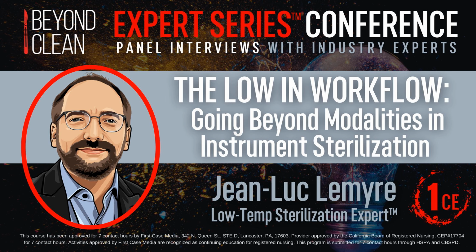Yeah, so limitations are different based on the models and cycles, but generally they revolve around the type of device, and you mentioned lumens. Lumens are very challenging to sterilize. We need the sterilant to penetrate through them, so the diameter and length of the lumen matter. There are specific claims per cycle and sterilizer that users need to be aware of. Other than that, there's geometry and weight, there's a weight limitation not to exceed. So these are some of the limitations that users need to be aware of when they load the low temp sterilizer. Yeah, that's really helpful.